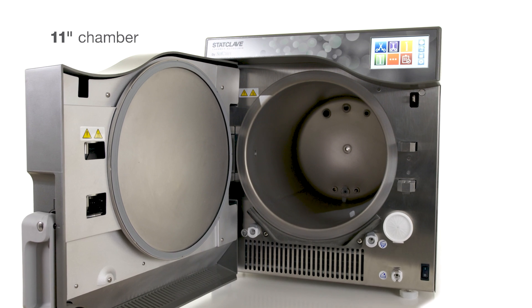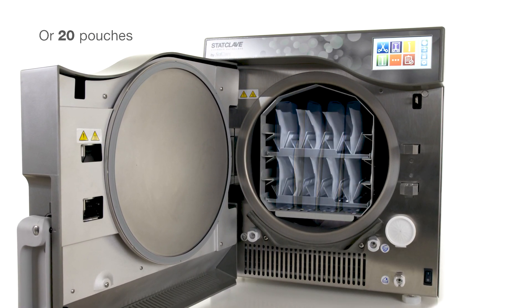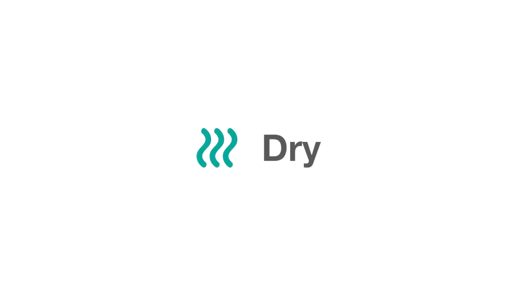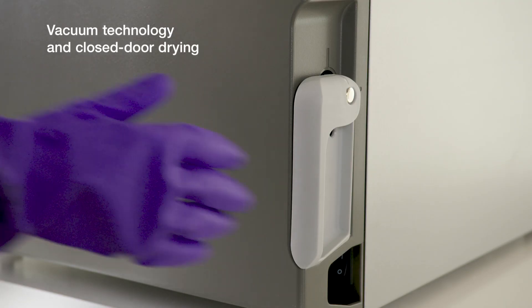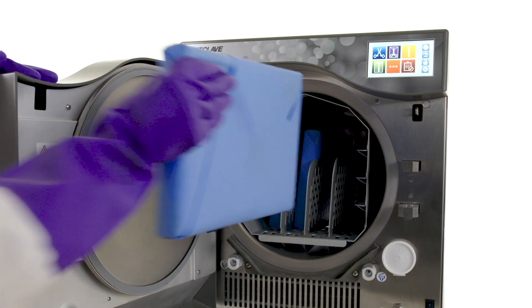The 11-inch chamber can sterilize up to 4 full-size cassettes, 4 exam cassettes or 20 pouches. Vacuum technology and closed-door drying ensures StatClave produces perfectly dried instrument loads every time.